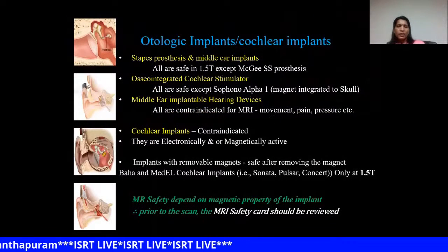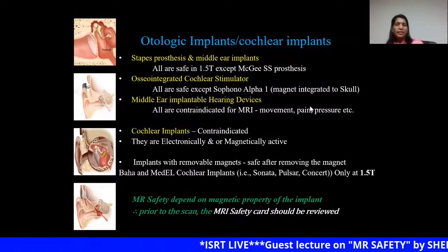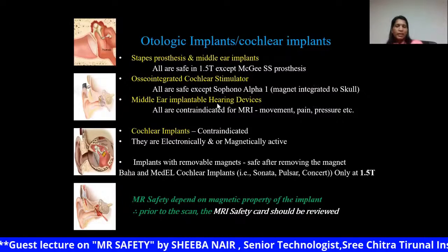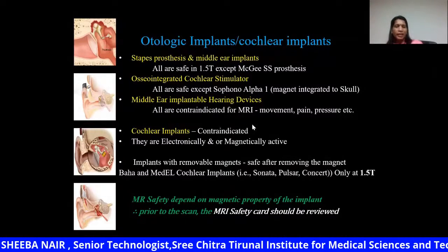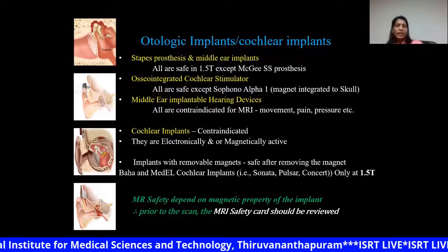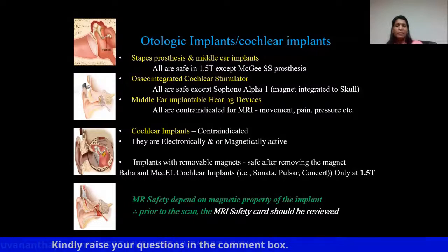Most otological implants, we have to check for MR compatibility. Because these devices have electronically or magnetically active components, it is always better to identify the make and model of each device, and only those that are MR conditional can be taken by following the safe conditions.